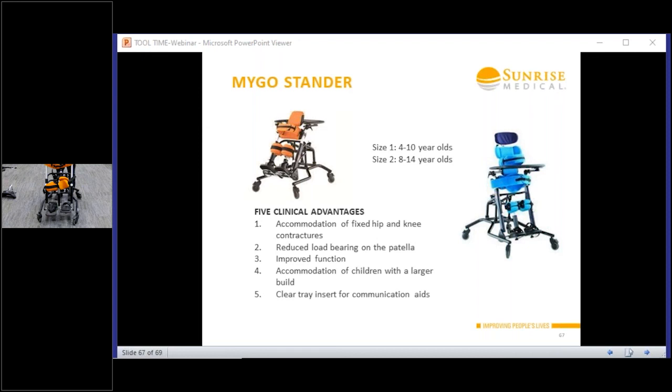Worst thing you're going to do is a screw or a washer's going to fall out. But it's normally got a safety device so that if it does fall out, everything's not going to fall apart. If it does, it's going to be fairly straightforward to put back together. This one goes all the way into horizontal as well. So you're going all the way, and you've got that safety pin as well.